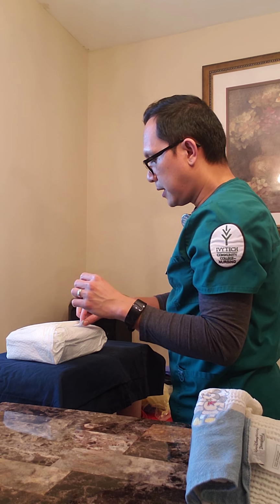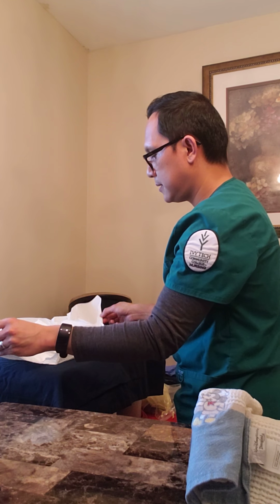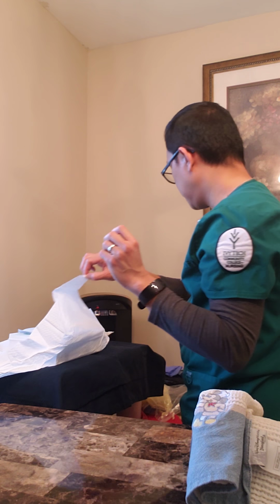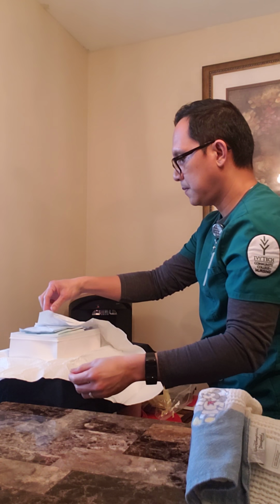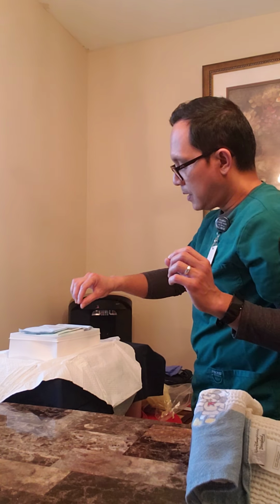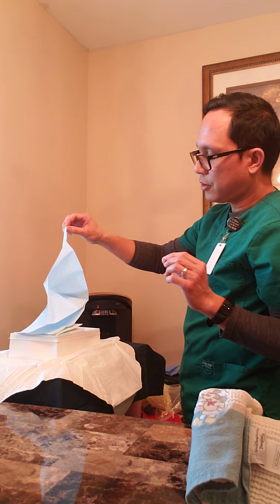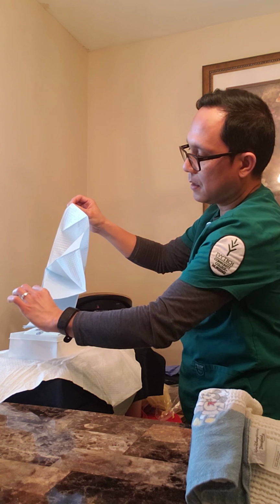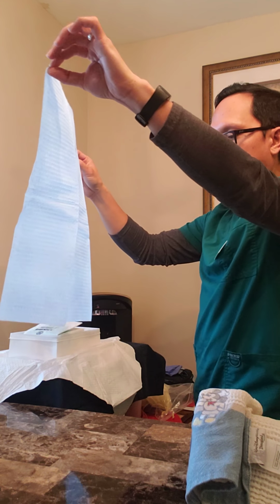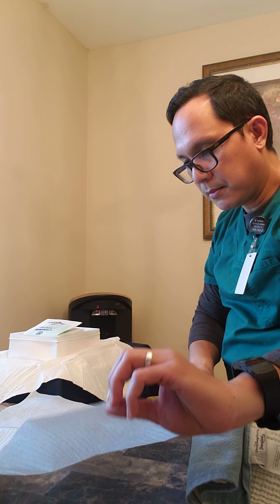I want to make sure I carefully open the kit without touching anything inside because it's a sterile kit. Now I'm going to grab the sterile drape and then carefully put it in the middle of my patient's legs.